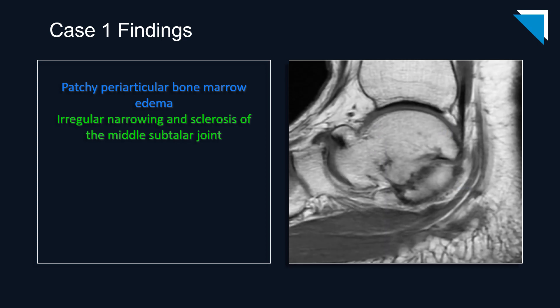It's a little more conspicuous on the sagittal non-fat saturated T1-weighted image. This is a case of tarsal coalition, which is not foremost in most of our minds when reviewing cases like this, but can be a cause of chronic pain. Let's talk a little bit about tarsal coalition.